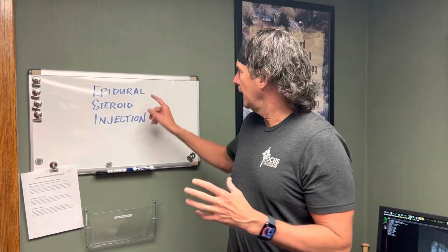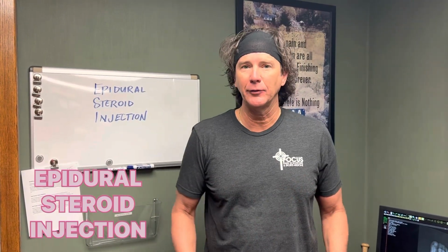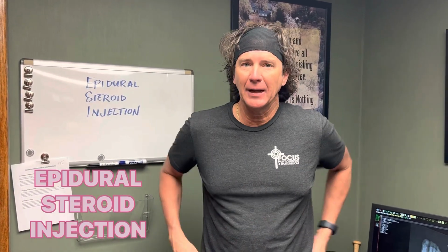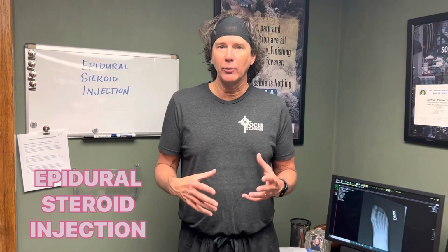So one of the procedures that we do here in the office is called an epidural steroid injection. This is mainly to treat back pain and leg pain. This pain that you get is called sciatic pain or radicular pain. People get pain across their back that shoots down into their leg, and when they bend or lift, it aggravates that pain. So this is a procedure that we do for that.